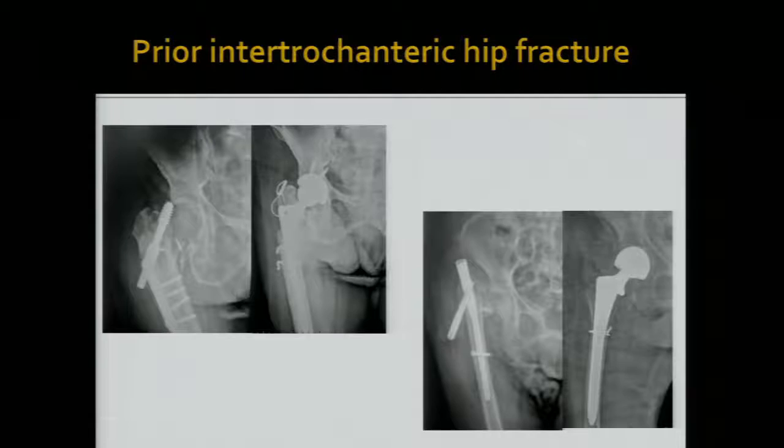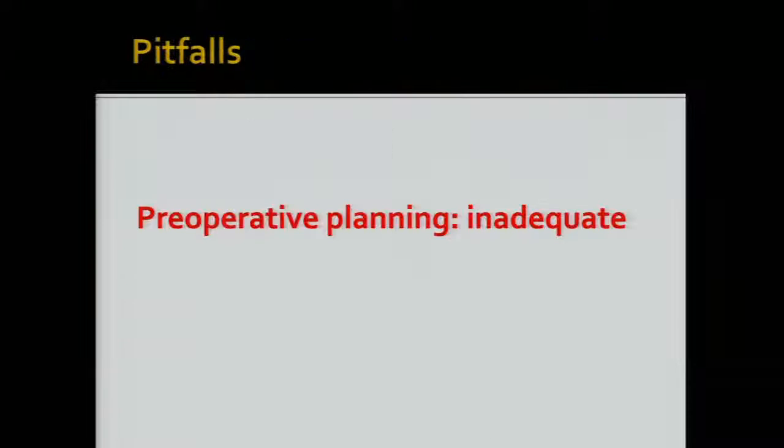Another situation that is becoming more common in our practice nowadays is fixation failure. The implant and fracture itself may cause some deformity at the metadiaphyseal area. This issue will soon come up in an excellent talk by Ajahn Saladet, so I will leave it to him.